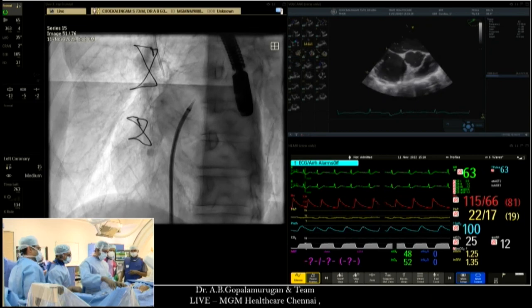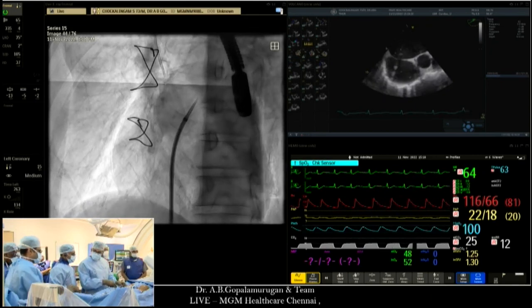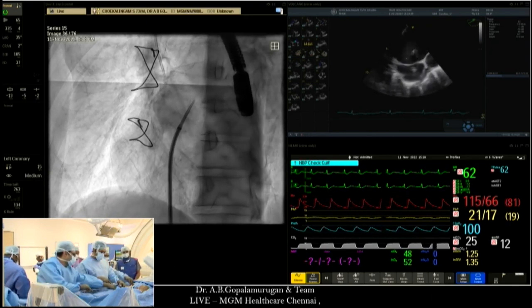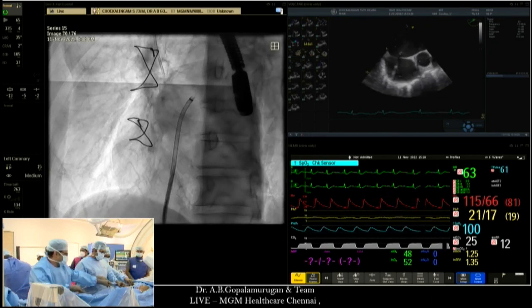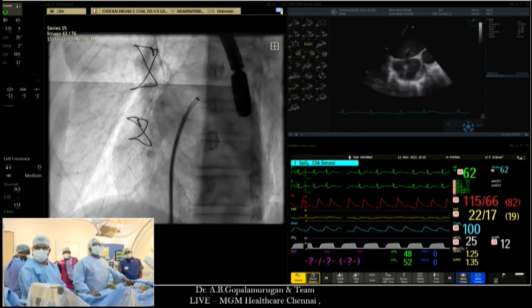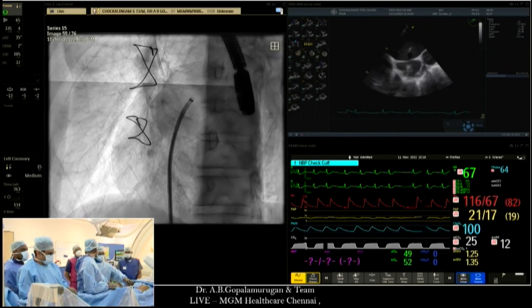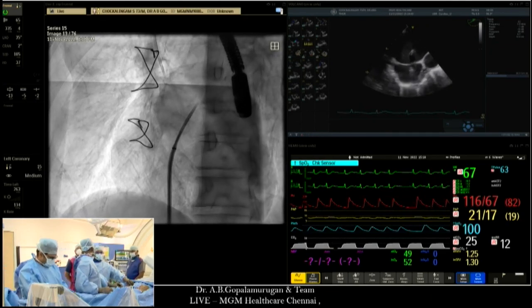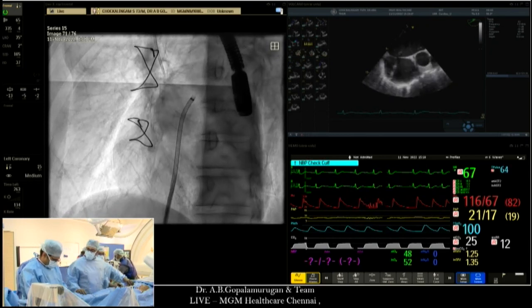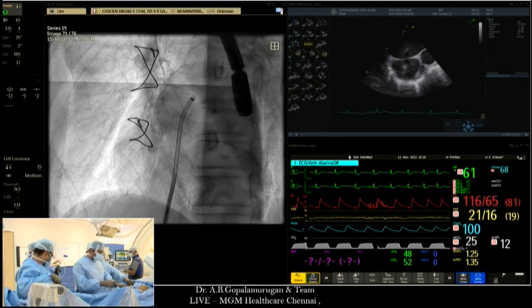So show us the catheter, please. Just make sure we're in the LA, everything out, please. Give me a Terumo and exchange for an Agilis. Okay, so you can see on TOE, the catheter is in position, and anticoagulate, please. Give us some more. Yeah, keep ACT at 300 from now on. Thanks. Terumo wire. Let's give you an LA pressure.